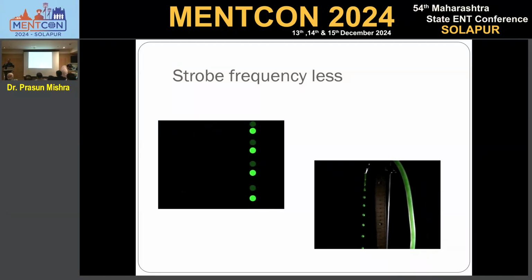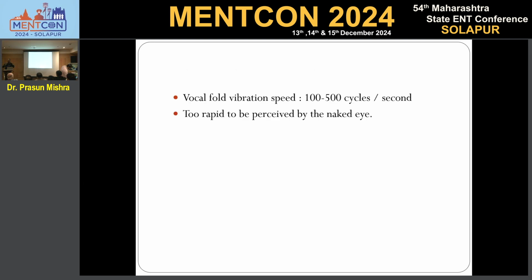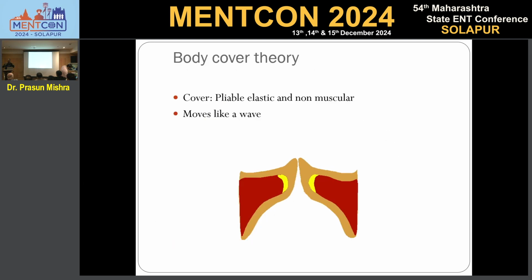The first point is noting down the fundamental frequency. It will keep changing. Today if I am saying it is 120, if I speak too much, my voice becomes hoarse, it can come to 110 also. And if my voice becomes shrill, it can go to 200 also. So first point is F0, all of us should be noting it down. I'm skipping the basic physiology part.